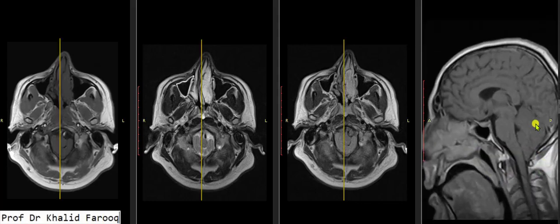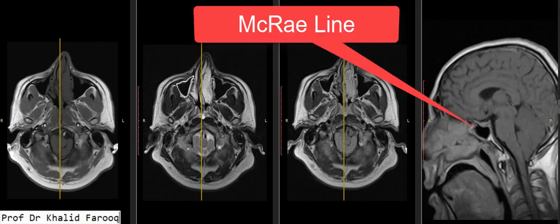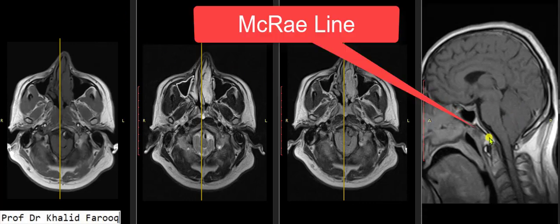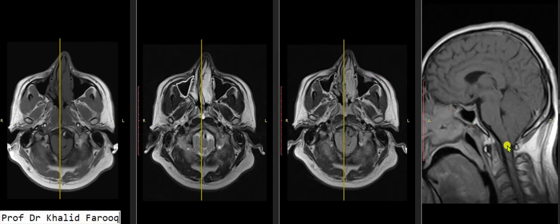On sagittal images, this is the anterior lip of the foramen magnum and this one is the posterior lip. We can see that the cerebellar tonsils are noted below this line, and we can also see that there is mild downward herniation of the cervicomedullary junction through the foramen magnum as well.